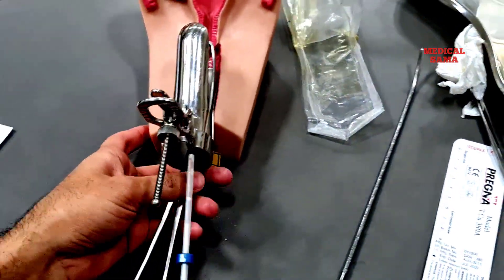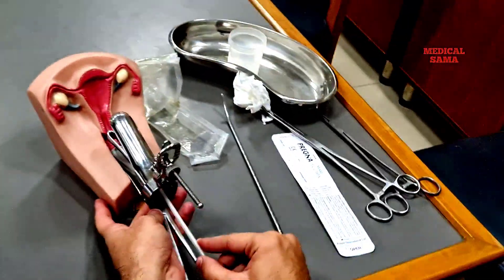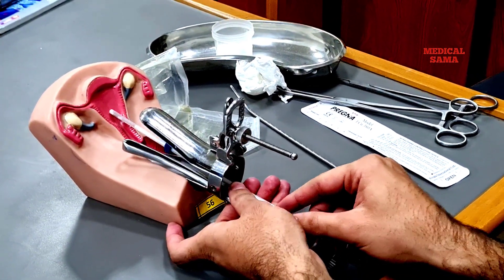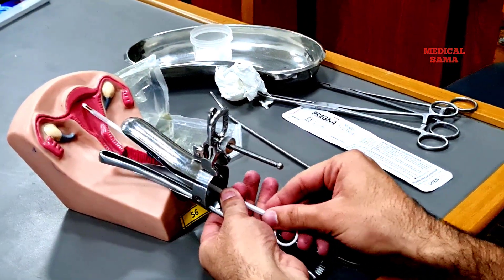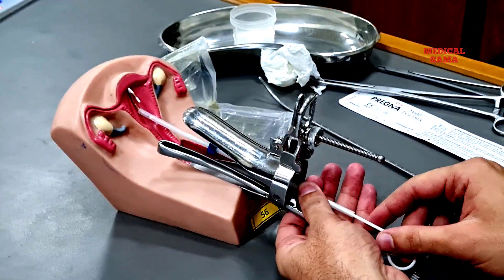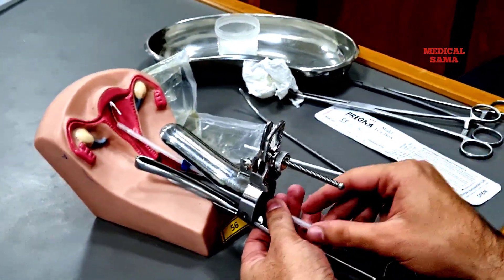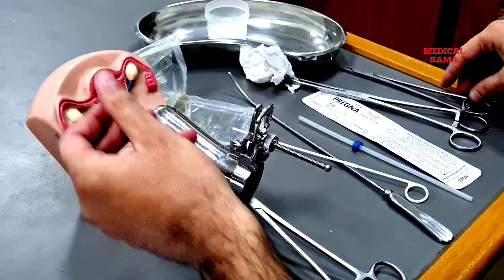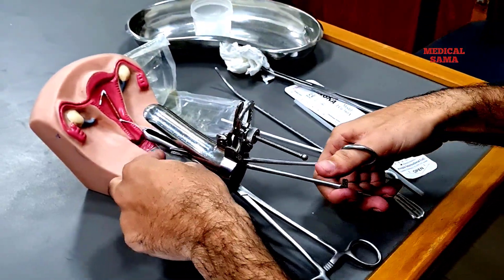Now insert the IUCD into the uterus. Give a little push, then remove the white rod first and then the sheath. Cut the thread to approximately 2 centimeters.